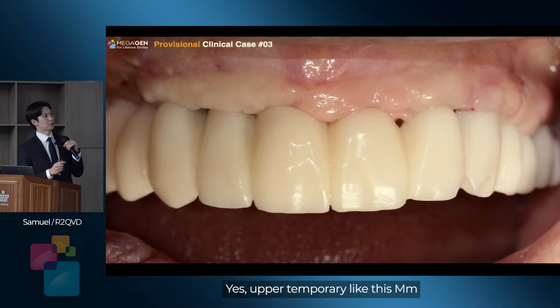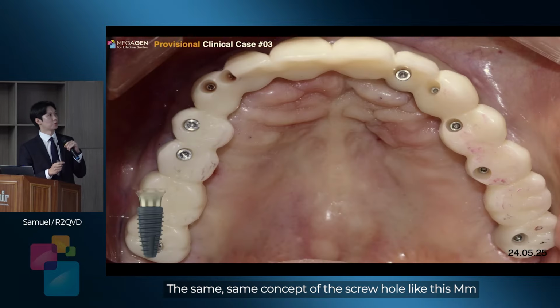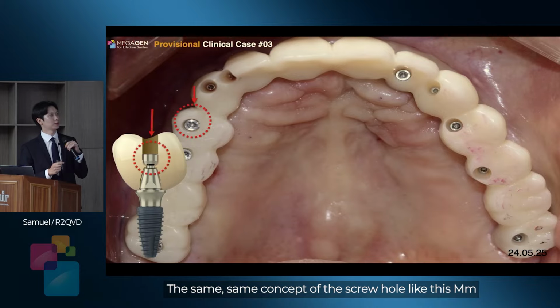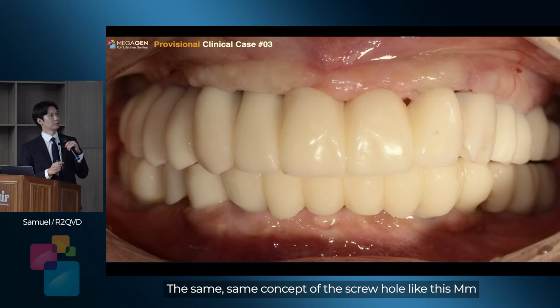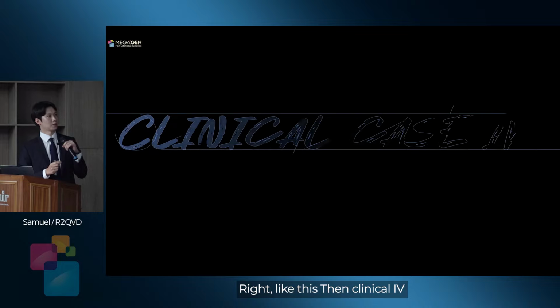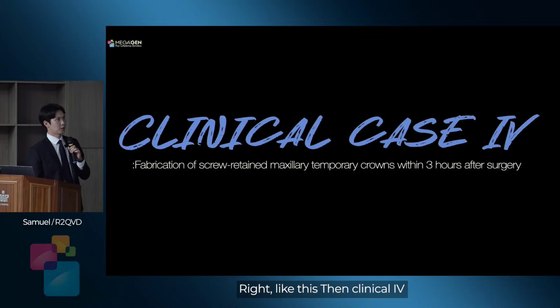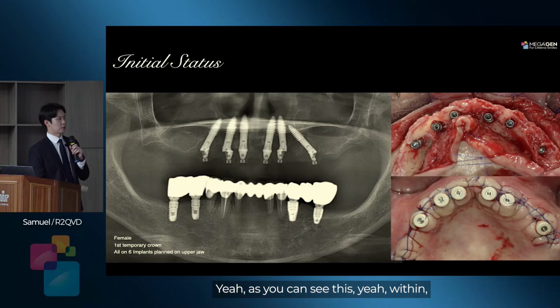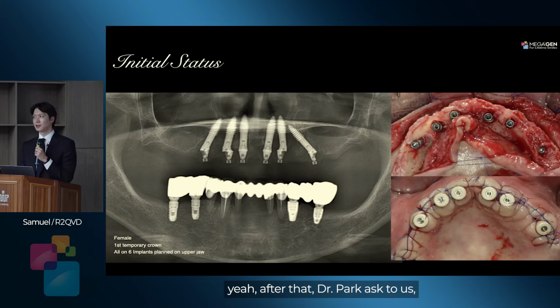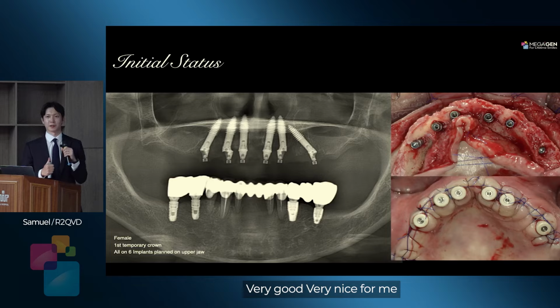Yes, upper temporary, like this. It's the same concept of the screw hole, like this. Then the clinical part is the upper jaw. Yeah, as you can see, after that, Dr. Park asked us, yeah, now QVD is very correct, very good, very nice for me.